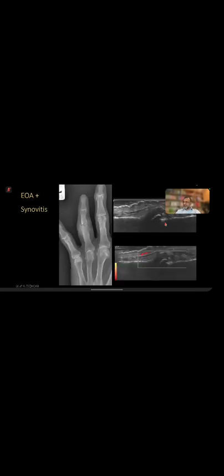And we did the injection in this patient. You can see those osteophytes there. This is all synovium. This is all thickened synovium, although it's not acute synovitis because there is no neovascularity, but this is chronic synovial thickening in erosive osteoarthritis.